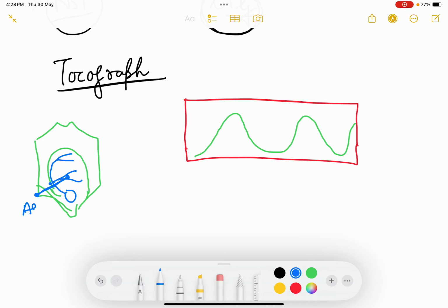Spino-umbilical line is from the anterior superior iliac spine to the umbilicus. So we divide it into medial 2/3 and lateral 1/3, and that junction is for the fetal heart sound. So the fetal heart sound probe is placed over there, whereas the toco probe is placed at the fundus of the abdomen, that is the highest part of the uterine fundus, there you place the toco probe.